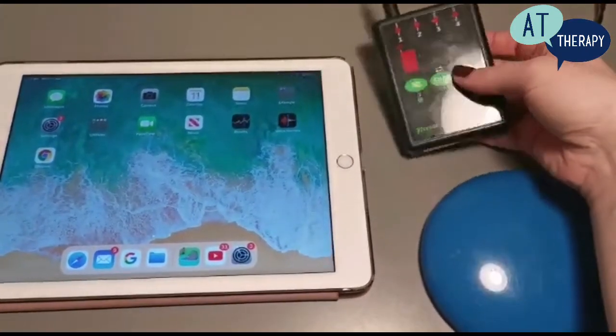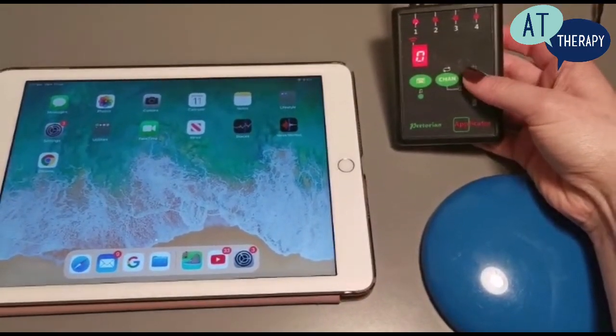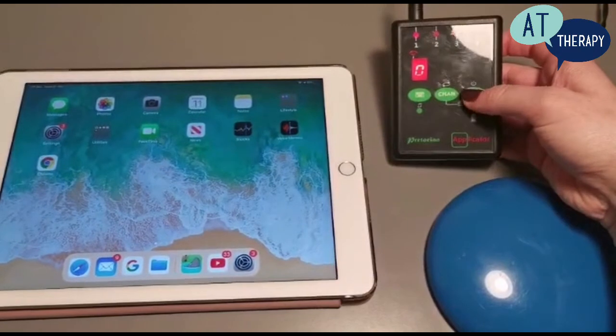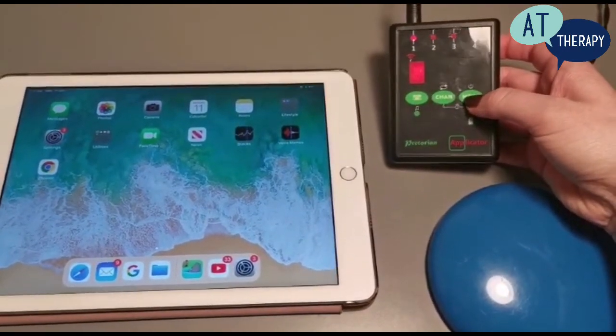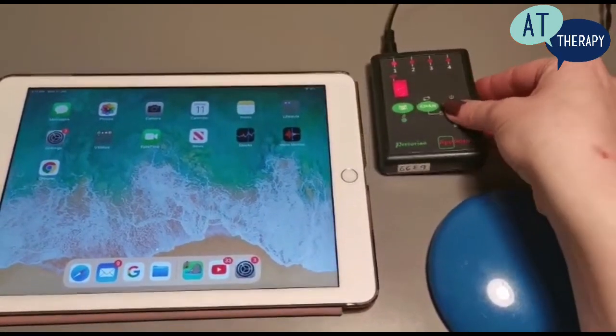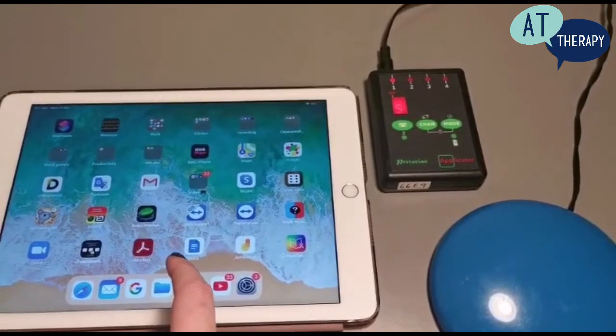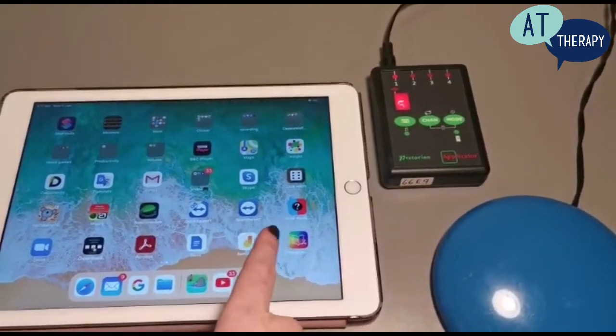Next we are going to have a look at mode 5. This is to allow us to use the switch within a switch activated app. As you can see, switch port one light is lit up showing that we are changing the mode on the appropriate switch port.